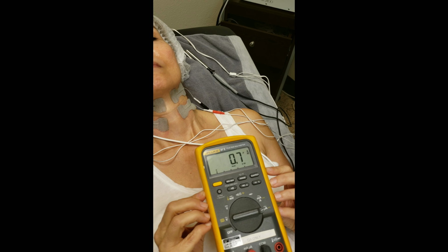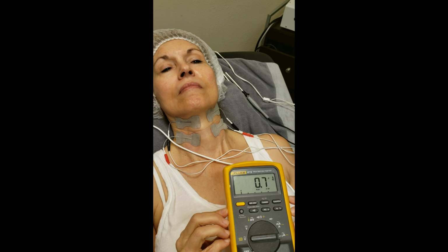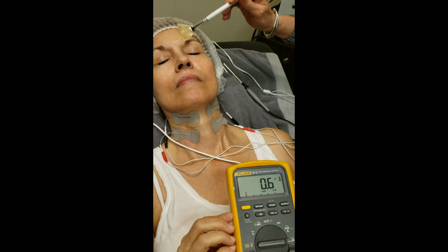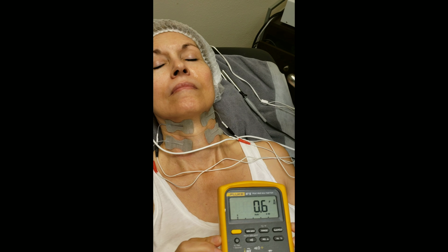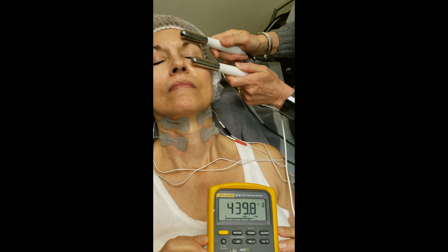So Patty, why don't you connect the probes to the skin and see what kind of value we're going to get. Go ahead and place the gel and connect it to the same area that you did the other probes so we can compare apples to apples. So let's try it out and see what we get.